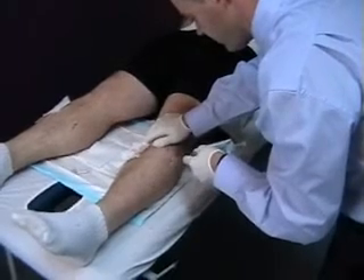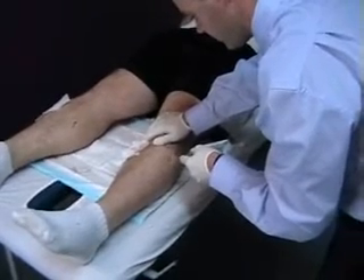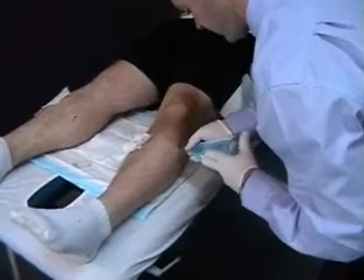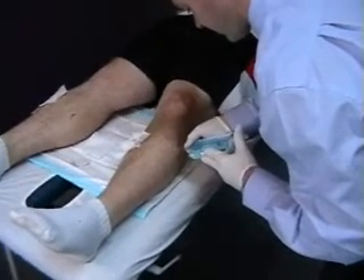It's a little bit tough with Blake. I'm basically just equalizing some pressures with some saline in the compartment.